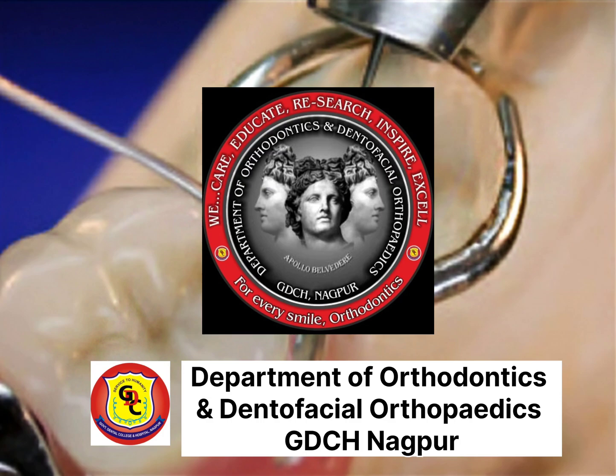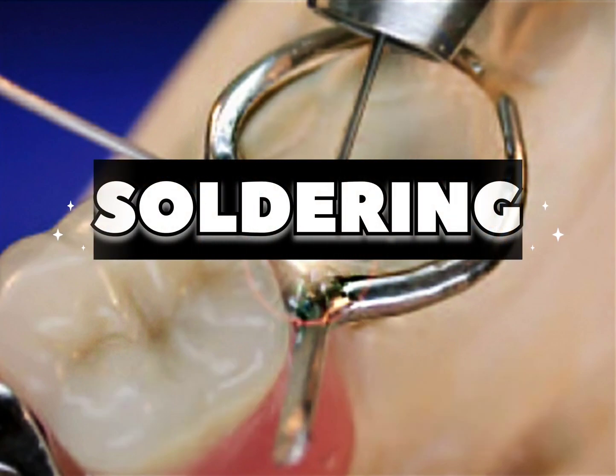Department of Orthodontics and Dentofacial Orthopedics, GDCH Nagpur, presents a demonstration for soldering.